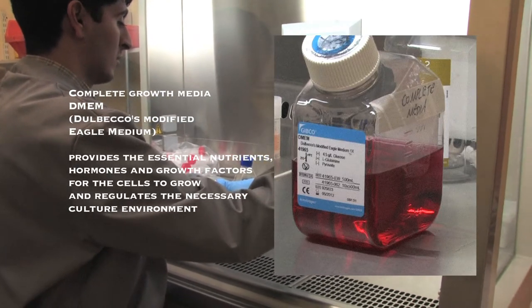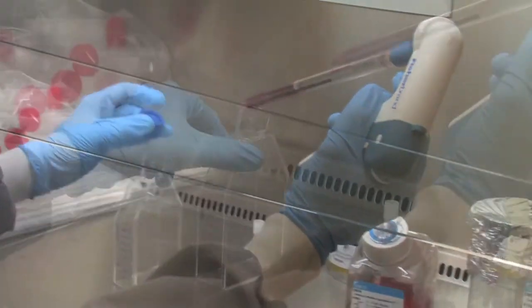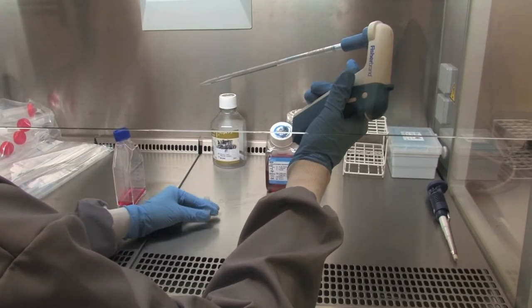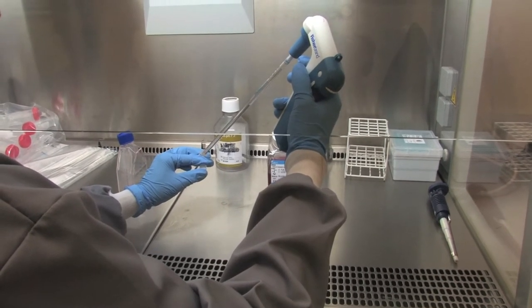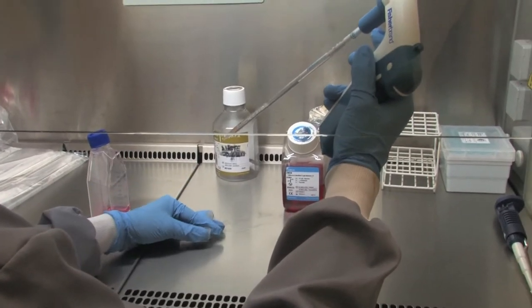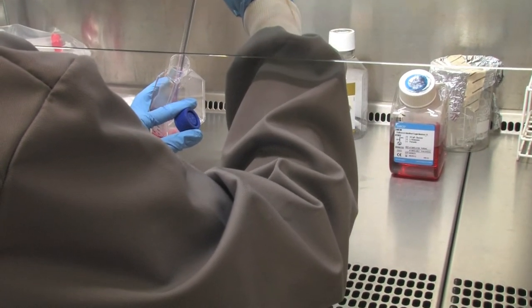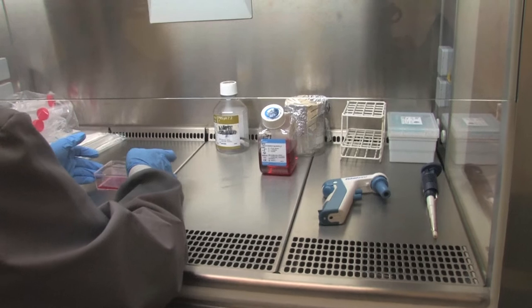10 ml of pre-warmed complete growth media is then transferred into a culture flask. The cell content of the cryovial is then transferred into the same culture flask. The culture flask is placed flat and agitated very gently.